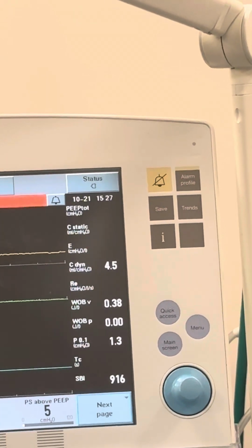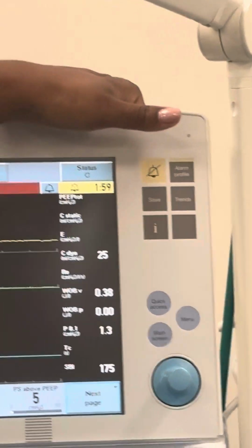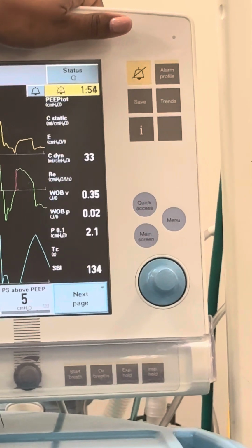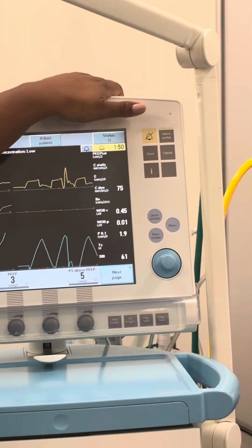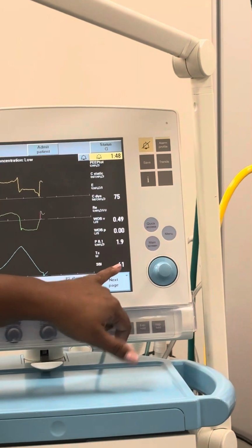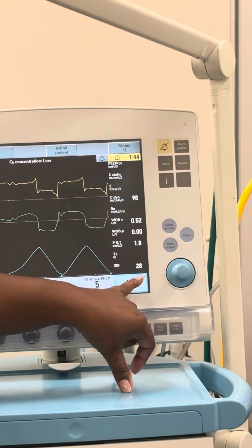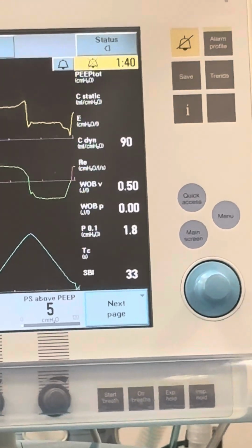Michael, come on this side over here and breathe for me. I want to see if it's the same one. Take a really good deep breath. Let's see, wait a minute. Now. Okay, there it goes. Where do I want it under? 105. 105. So this one actually is reading 28 to 35. So that's pretty good, right?